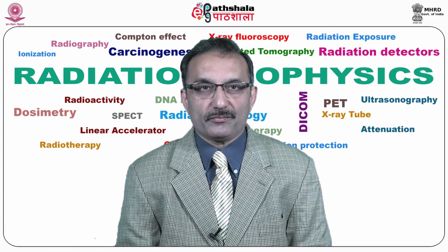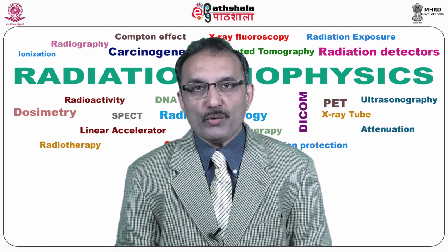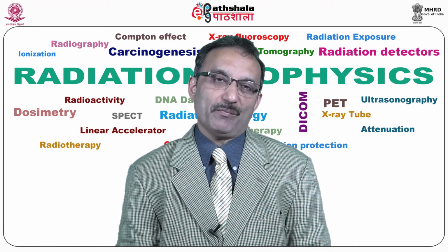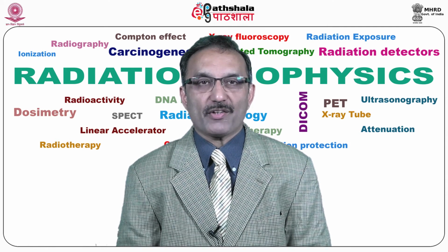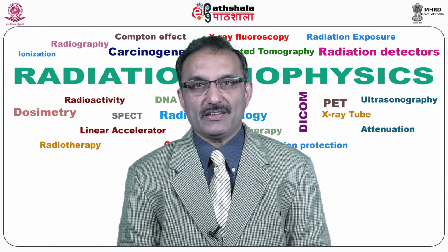Newer devices available may be able to perform 2 imaging studies at the same time, such as SPECT-CT and PET-CT. What does it mean? It means it's a hybrid technology where the CT has been combined with the gamma camera or SPECT and PET, and this is called SPECT-CT and PET-CT.